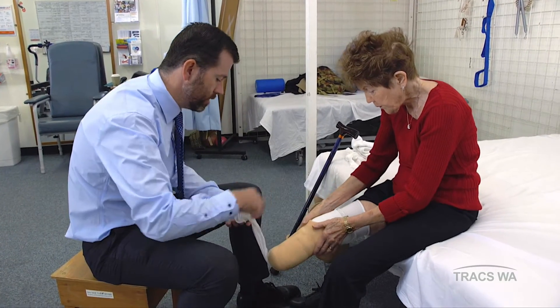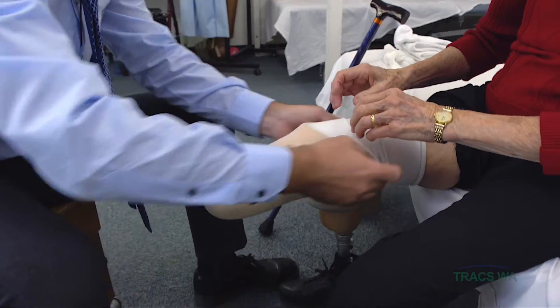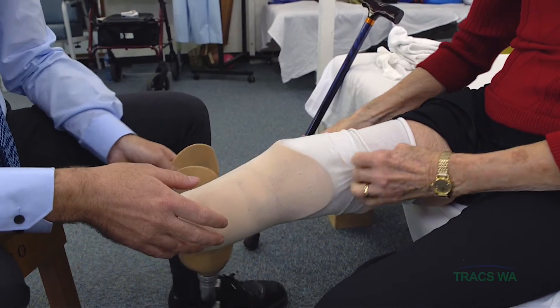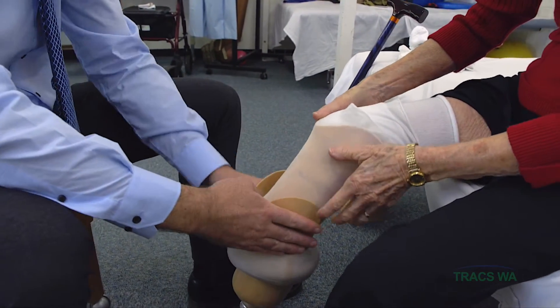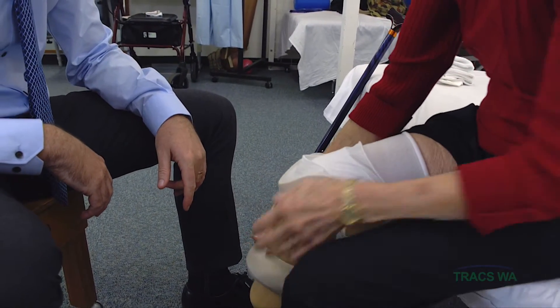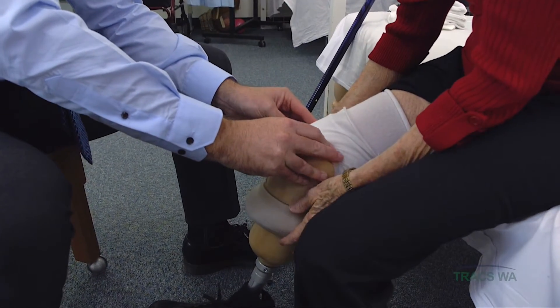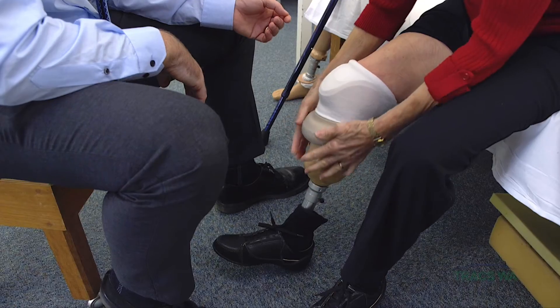Once that liner is on, I then turn that pull-through sock back over, just up to there. Then we slide the prosthesis in — just sort of lean forward onto it. It's really important at this point, Val, that you keep a little bit of weight downwards on the prosthesis until we get the sleeve in place. We don't want your leg popping out. Then rolling the sleeve up onto your leg.